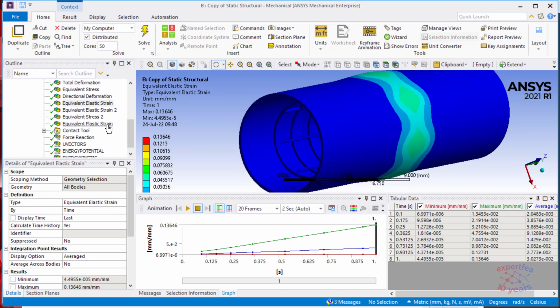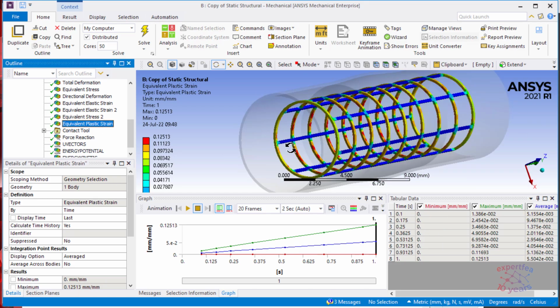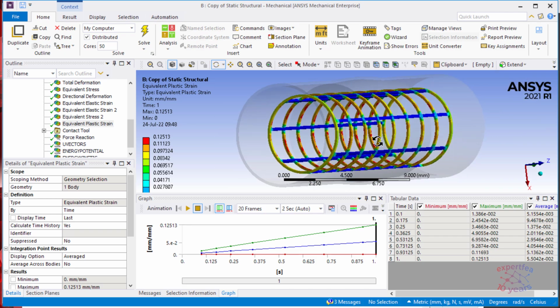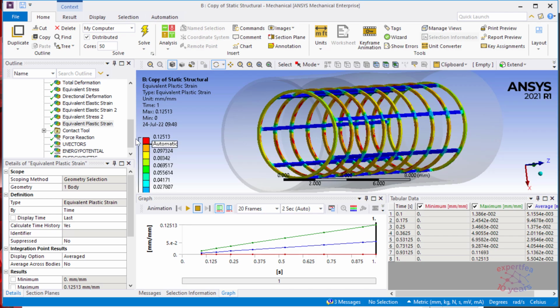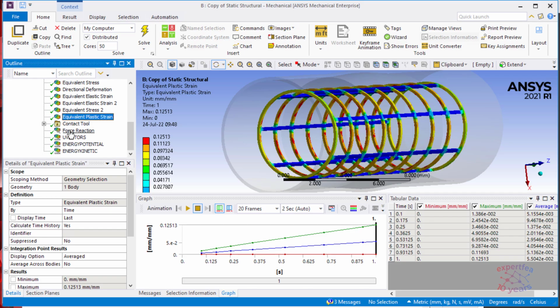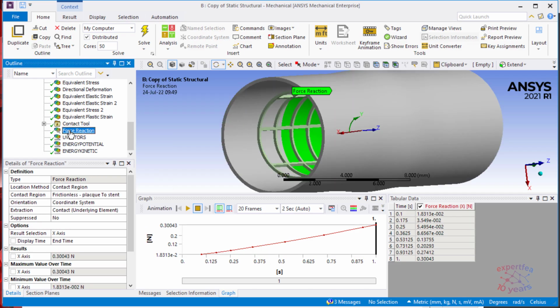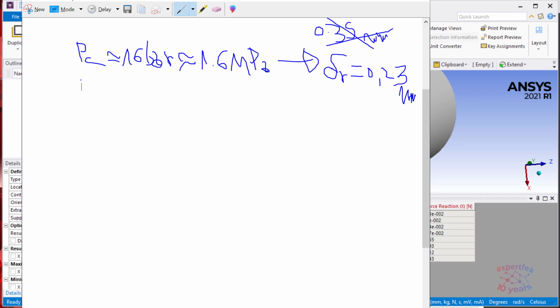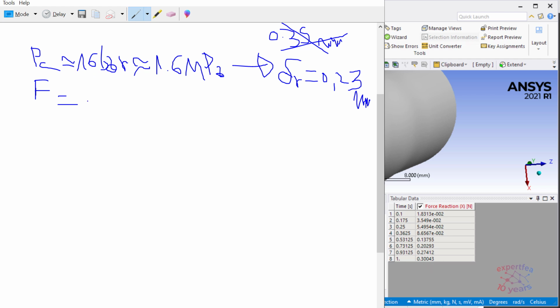The strain is much less. Let's look at the plastic strain on the stent. It has lower values. Now on the force reaction, so it's 0.3 now, yes. So we have a force reaction of exactly 0.3.